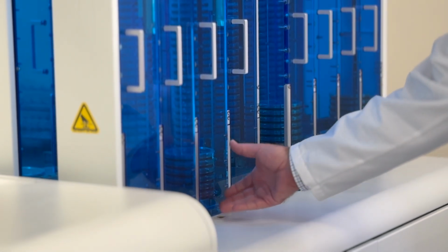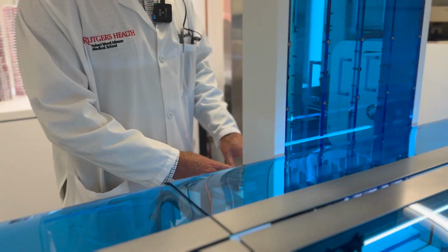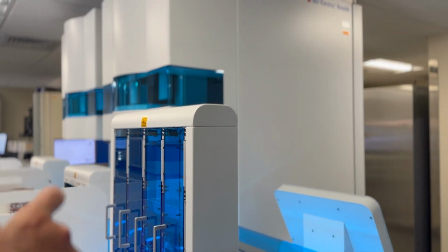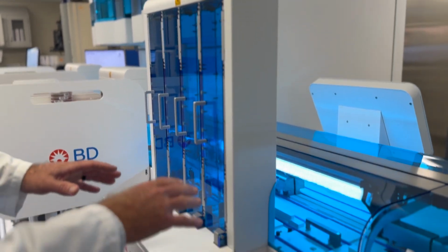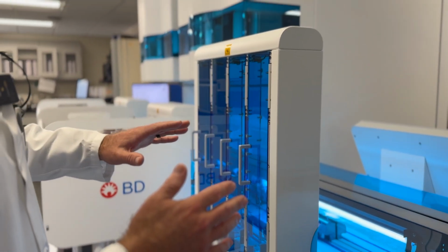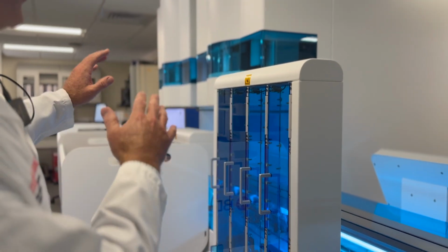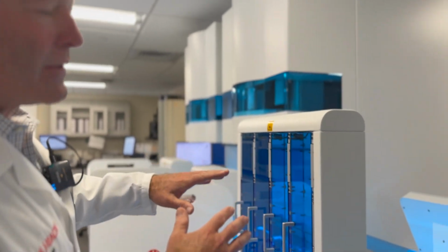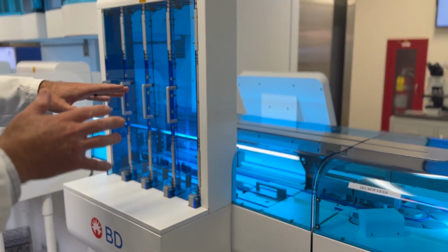So the technologist will take these plates out of here and then place them into our second instrument in the line here, which is our sorter and our incubator and our imager. The way that this instrument works is the plates are barcoded. They get sorted depending on the incubation requirements that they have. They'll either go into CO2 or standard air environments. They'll be incubated for a certain amount of time depending on what type of culture they are.